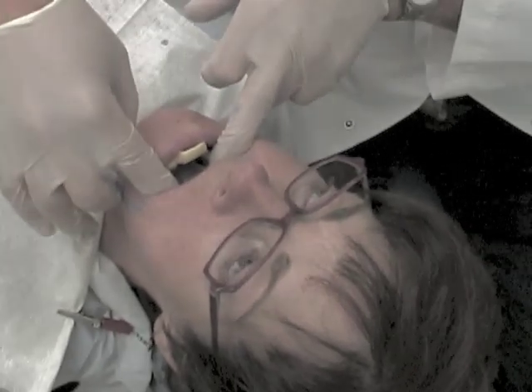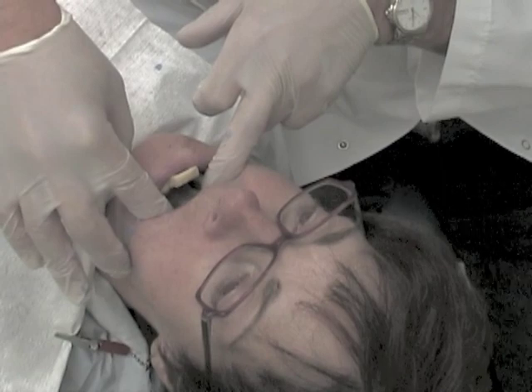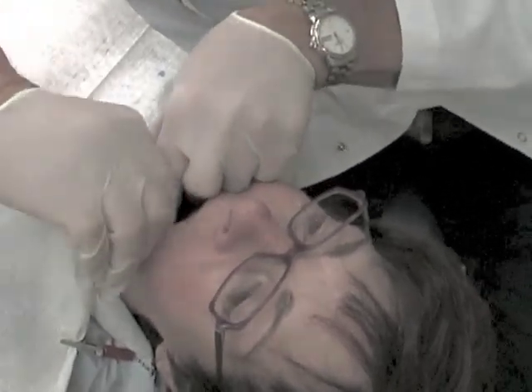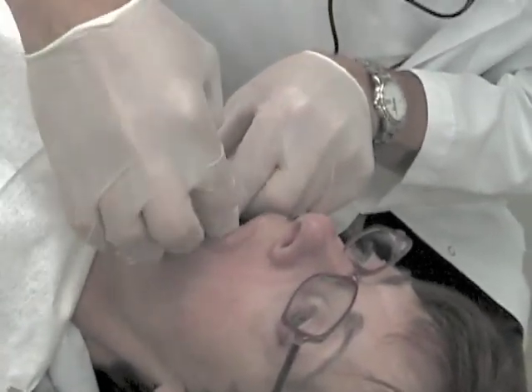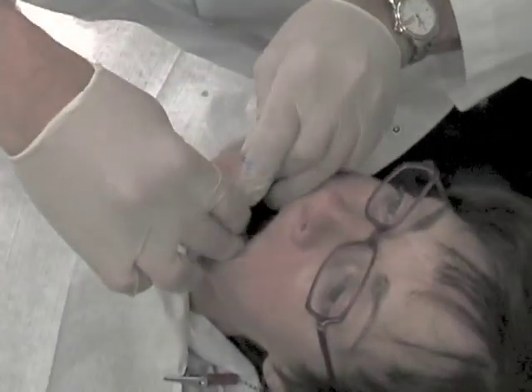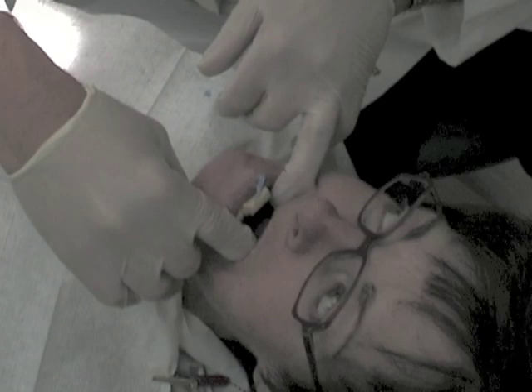When border molding in the mandible, particularly in the lingual area, we will simulate these same motions. We will have the patient stick their tongue out, move their tongue from side to side, and lick their upper lip, as well as all of the buccal movements used in the maxillary arch. The basic procedures are the same. The movements in relation to the lingual aspect of the denture are a little bit different, but otherwise it is a very similar procedure.